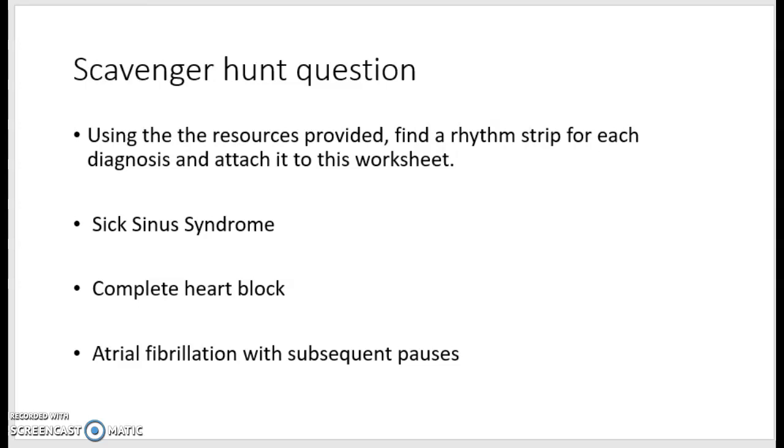As you guys have already done this lesson, we are doing a new take on it. I would like you to, using the resources provided, find a rhythm strip for each diagnosis and attach it to the worksheet. Sick sinus syndrome, 70% of all pacemakers are put in because of this. Know it, breathe it, live it. I want you to see this in your sleep. When you see an EKG of a sick sinus syndrome patient, say, perfect, let's put a pacemaker in them.